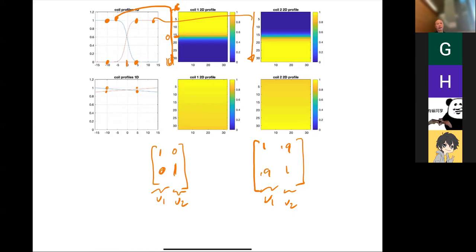Luckily, there are people whose whole careers are doing this. They're RF engineers and they simulate. You have a realistic E&M model of a head, for example, and then you simulate the coils and you look at all the RF fields.